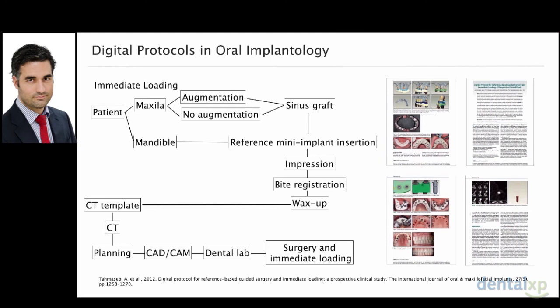There is an article published by Tahmakheb where he can do a PMMA prosthesis in CAD/CAM and place it on the same day of the surgery, but he has to do 2 surgeries. He has to do a first surgery where he places 3 implants, and then do another CBCT, and then do a planning, and build a prosthesis, and after that he can deliver.